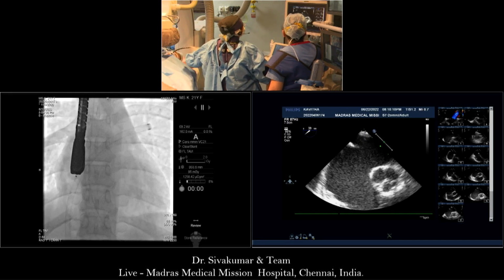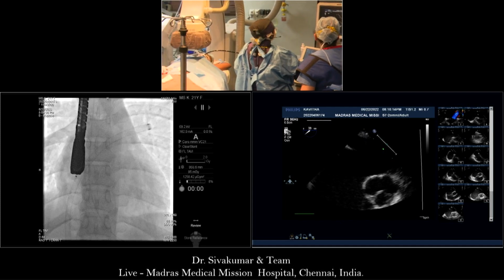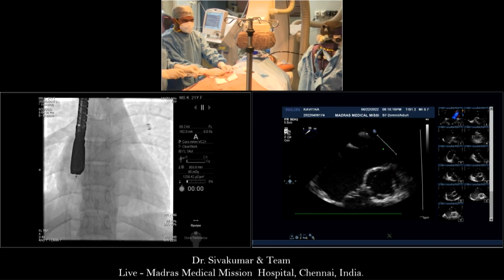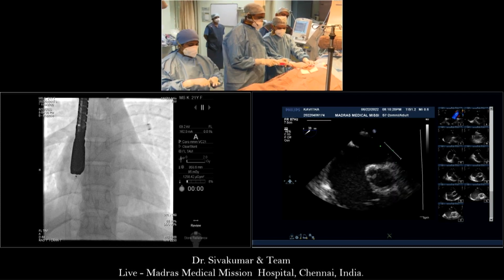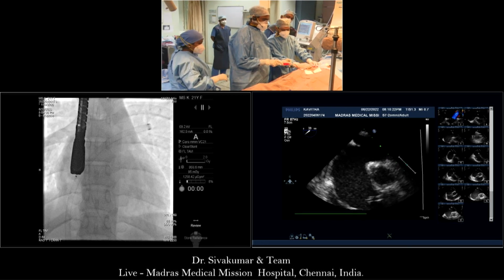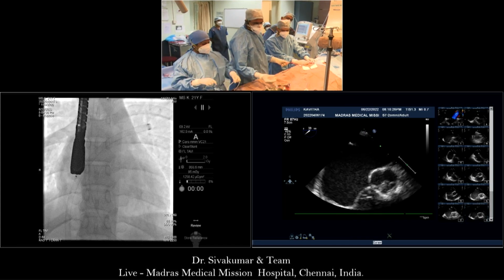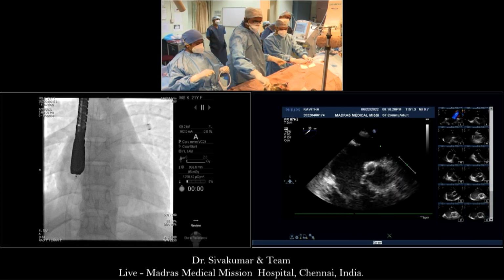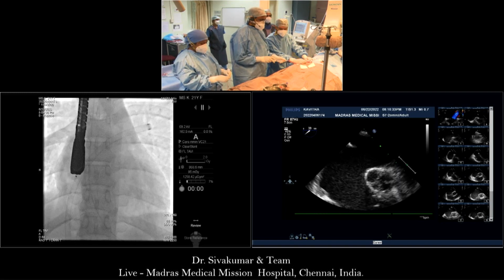Peter, your question is what size device would you use here, yes? Yes, exactly, without a balloon. Absolutely. So let's give a number. Give me three views we'll measure, and I'll give you the number. So far I've got 31 and about 23, and the last one is missing at the moment. This one we're about 28. 31 in four-chamber view was the biggest. And in short axis, if you measure now, please.